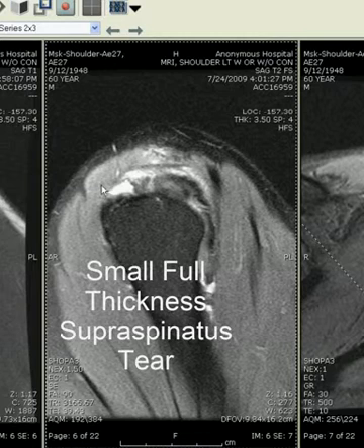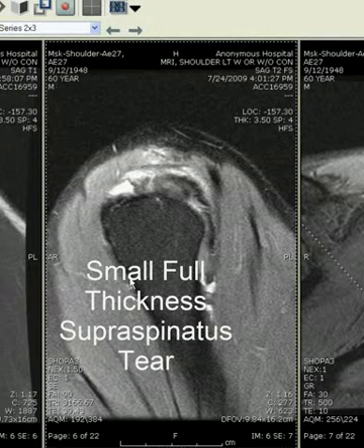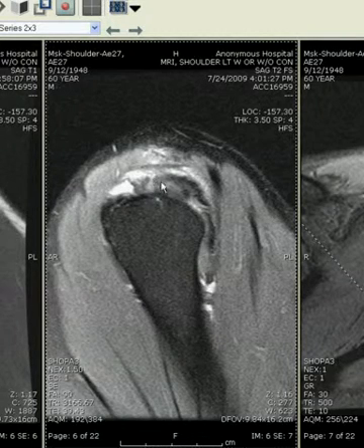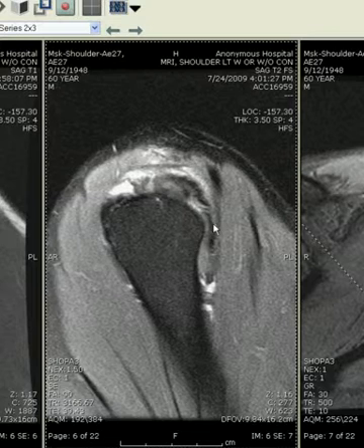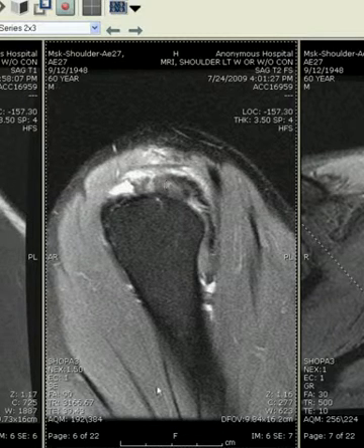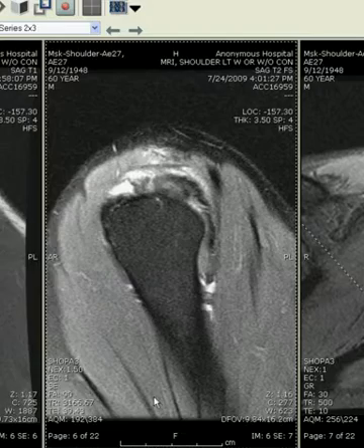So we have a small, full thickness tear in the anterior portion of the supraspinatus without evidence of muscle or tendon retraction, and the normal infraspinatus more posteriorly as well.